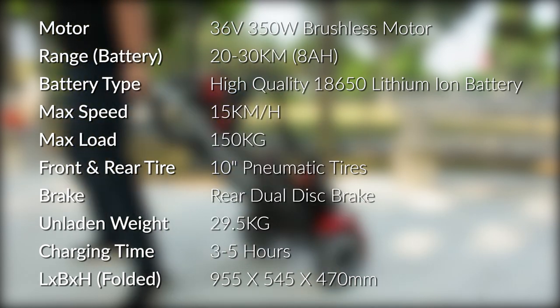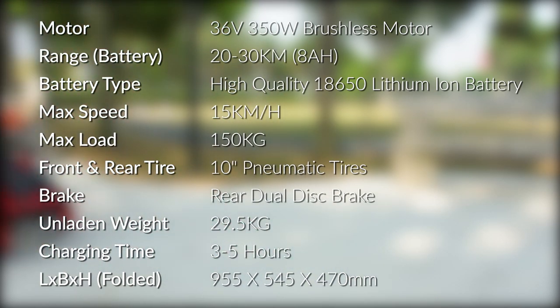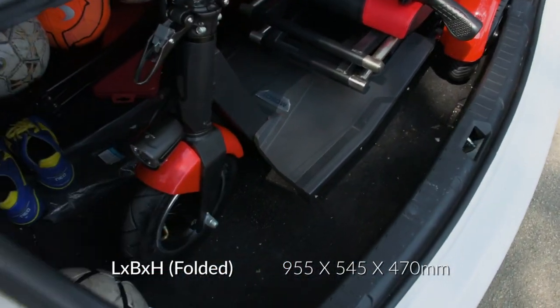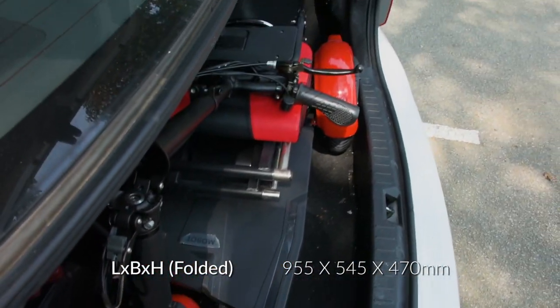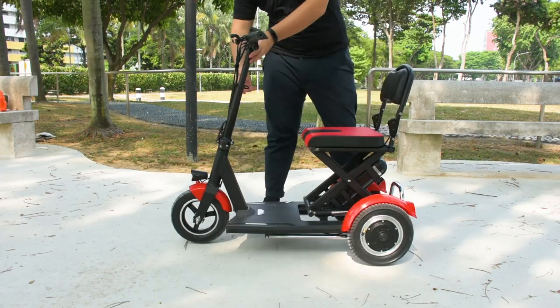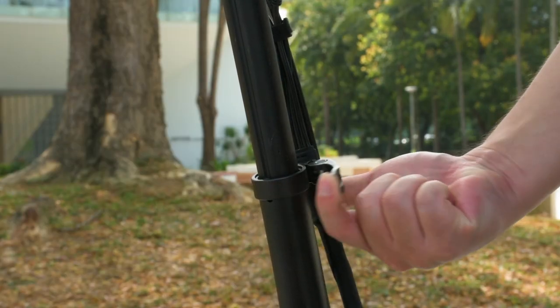The average charging time from empty to full is between three to five hours. Do check the dimensions to confirm if the Flexi Pro will fit in your car's trunk.